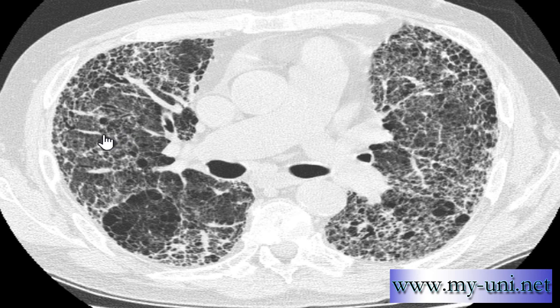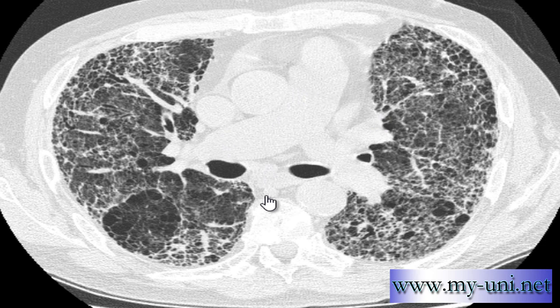Bronchiectasis is defined as an irregular dilatation of bronchi, which is clearly visible in at least two different places in the right lung — here and here. Also note the dilatation of the main and right pulmonary artery, suggesting this patient also has pulmonary arterial hypertension.